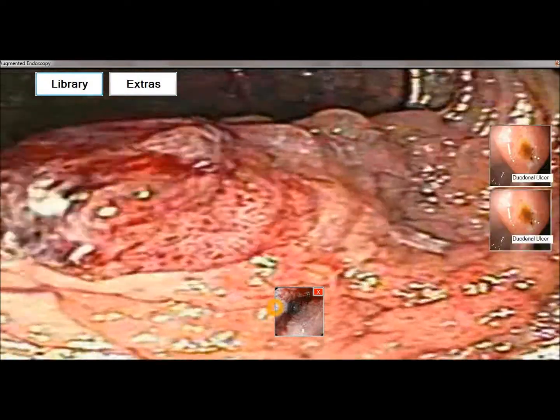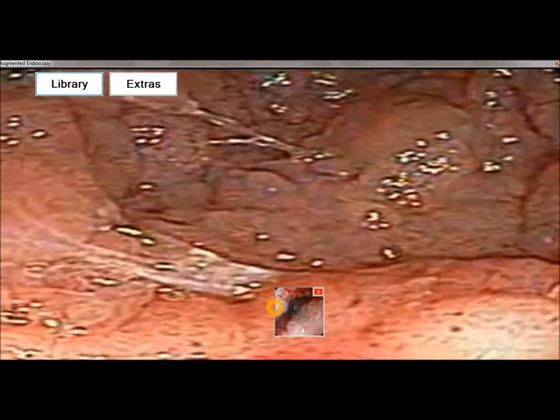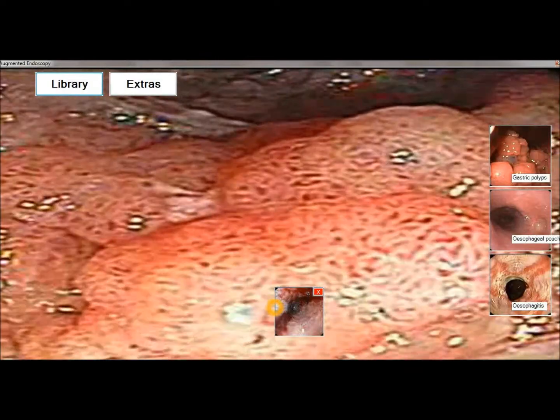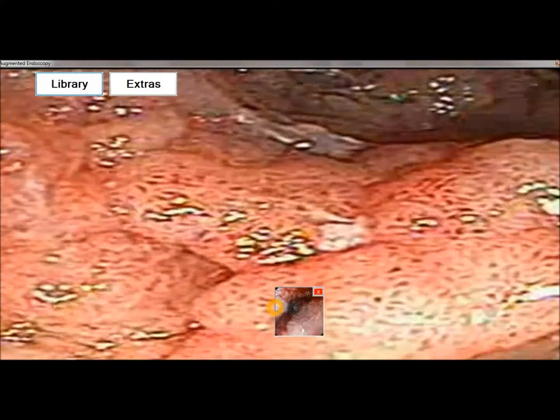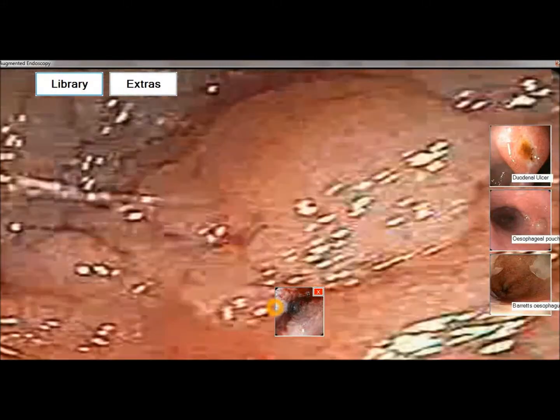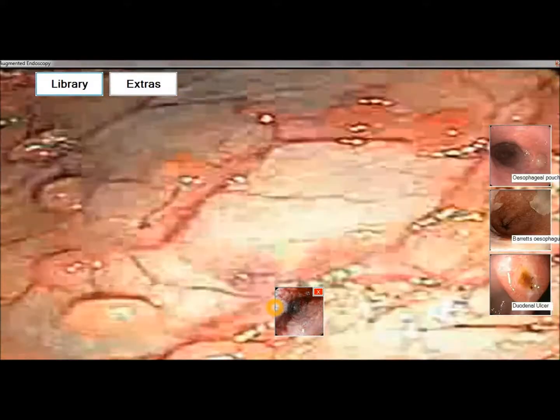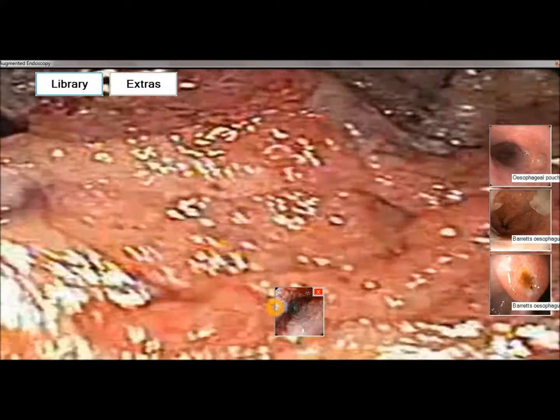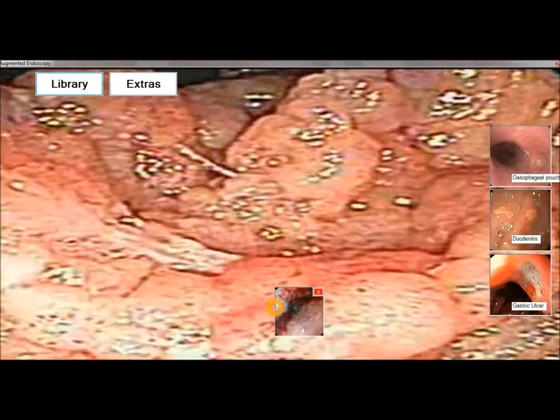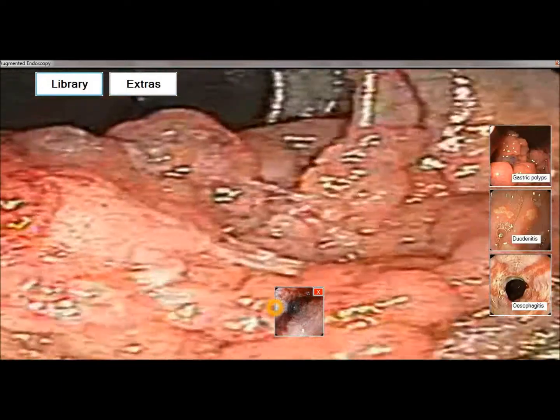The last method works by taking 4 different thresholds across the 3 image planes of red, green, and blue, and it also uses the hue saturation value of the image and thresholds this. These images are then laid across each other to give us 2 distinct results. These results then have the average colors taken of them, and these average colours are then compared to the average colour of damaged tissues, and the results brought up at the side.